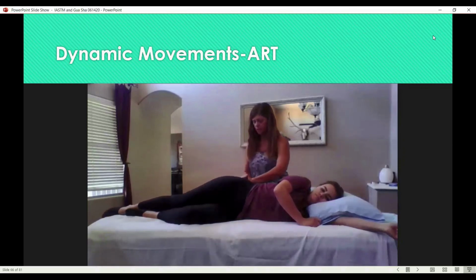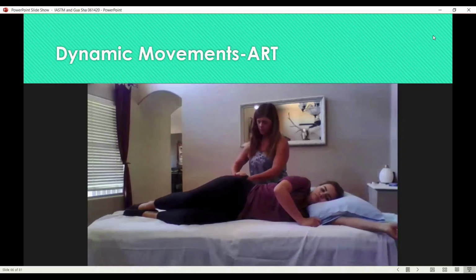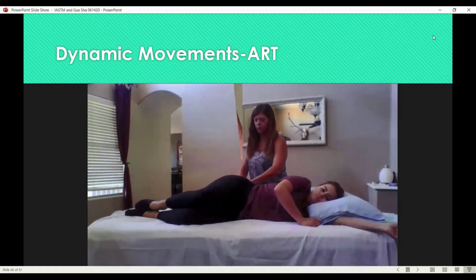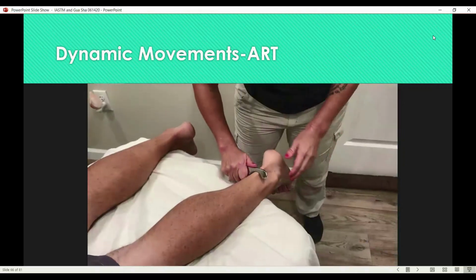Now we're just doing the heel slide, except in a sideline position. She's extending her heel down towards the window as I am working on all the deep six.